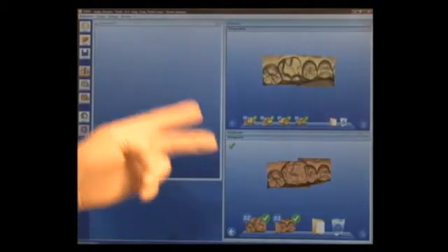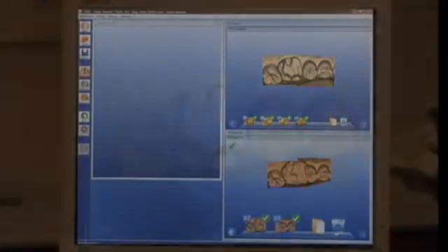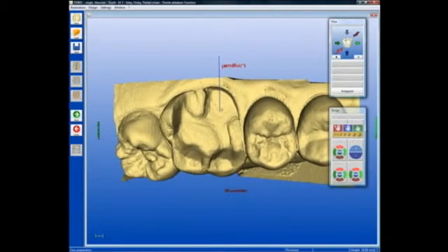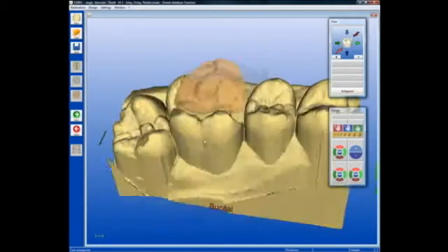Now we have both the bite registration and the preparation virtual model, and we're ready to begin the design for this onlay on tooth number 14. I'm simply going to go straight to the step of trimming the bite registration. The goal here is to trim the bite registration such that the only portion that remains is that portion which covers the prep itself. I'll draw an outline of that, and now we can see just the portion that covers the prep remains.